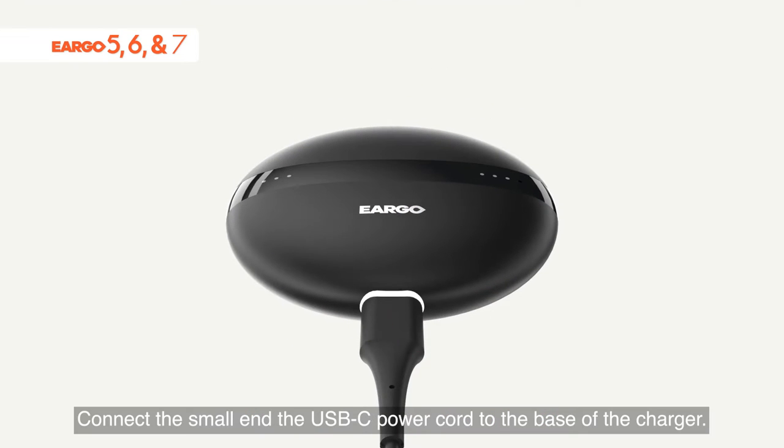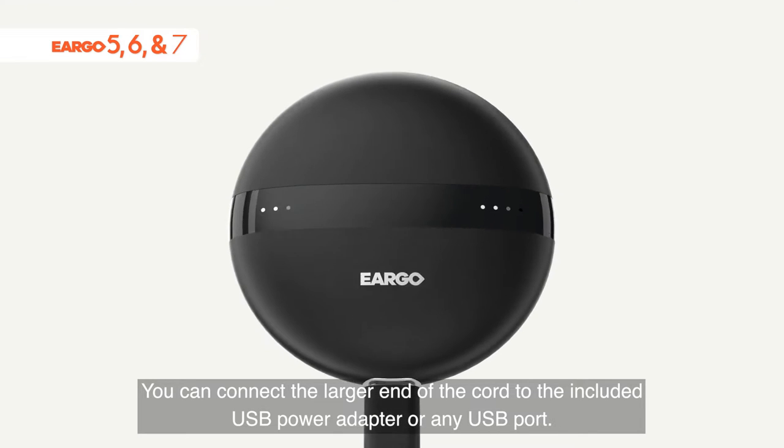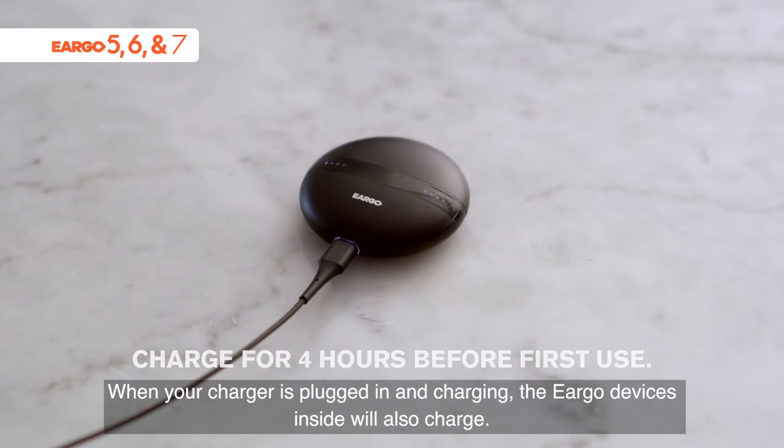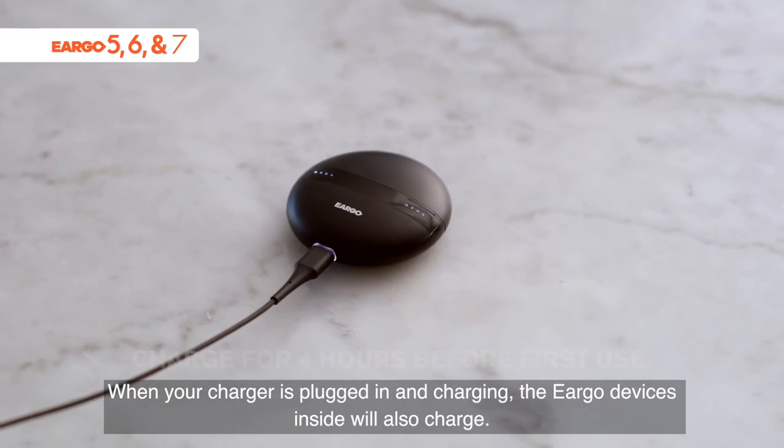Connect the small end of the USB-C power cord to the base of the charger. You can connect the larger end of the cord to the included USB power adapter or any USB port. When your charger is plugged in and charging, the Eargo devices inside will also charge.